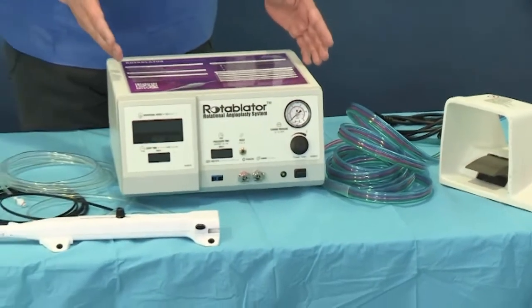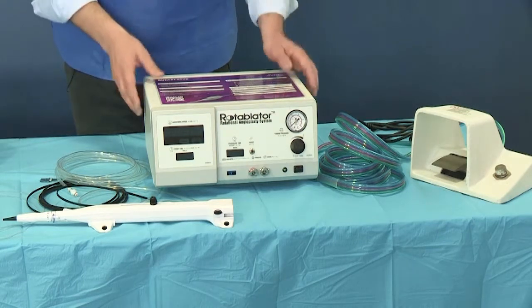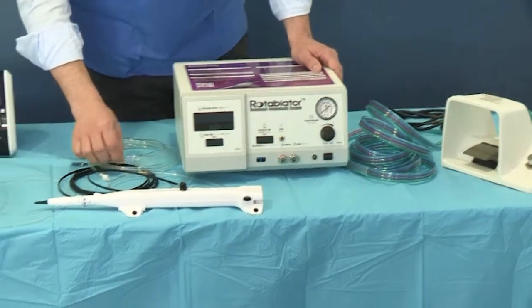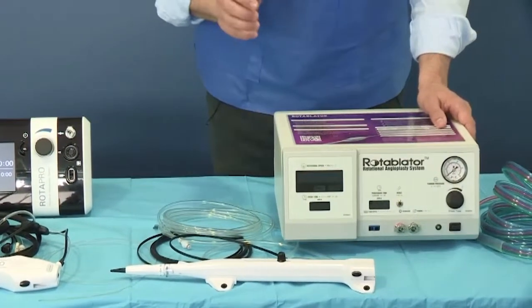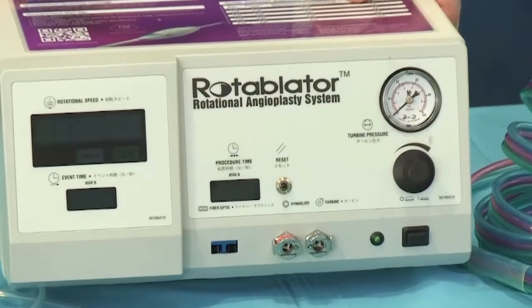Now, what was the reason why we had to change the current system to the new one? Well, basically to make the job easier for the operator, who will be more and more able with the new system, called ROTAPRO, to do this procedure on his own without the help of an assistant at the cath lab table, and to make the job easier also for the cath lab staff. In fact, all the issues related to the connection of all these cables with the console will be overcome in the new system, because there will be no way to make mistakes, given that all the ports here below have been significantly changed.